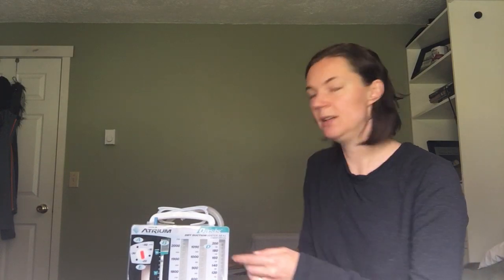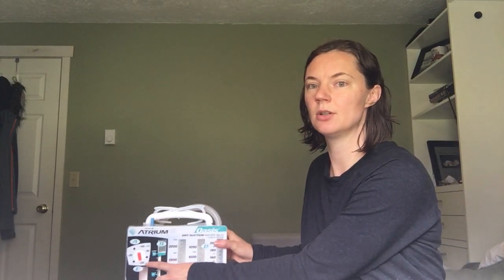You need to page the MD or PA and ask for a chest x-ray. They may need to go back onto suction if they've just gone to water seal. They may need to go up to a higher level of suction. They may ask you to turn the dial up to 30 or 40. They may need to go back to surgery. They may need their tube readjusted. But that's important to teach them and to have them call for, and especially after a chest tube's been removed, they need to call you for those things.